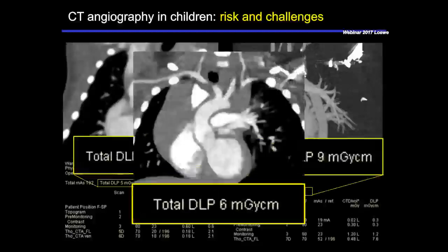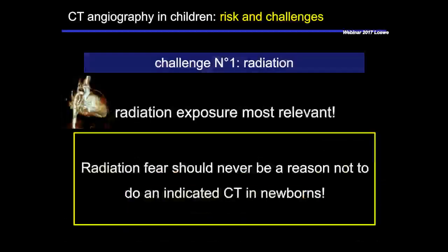So it becomes really possible to go for very, very low dose examination protocols. As a summary and rule of thumb, the radiation fear should never be a reason anymore not to do an indicated CT, even in very small newborns. If it's needed, you should go for it, because the radiation dose has become that low.